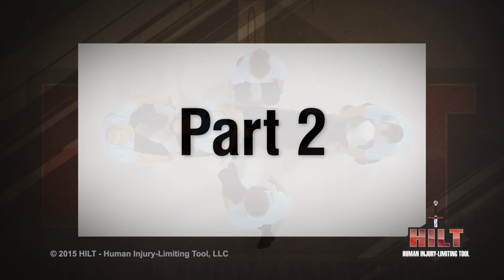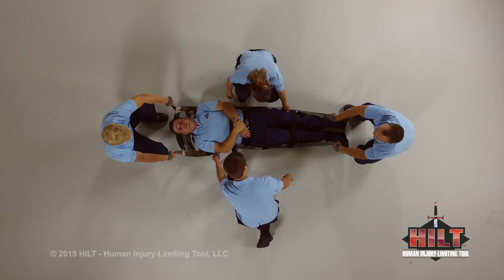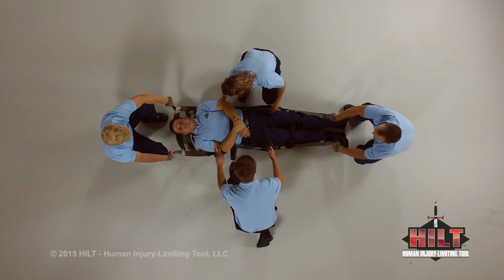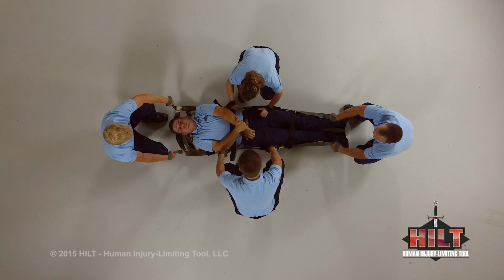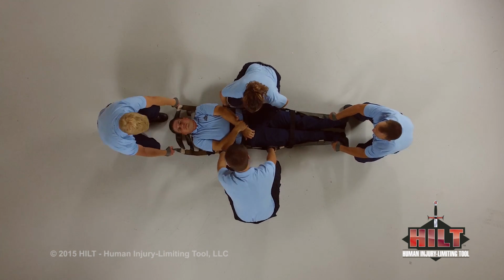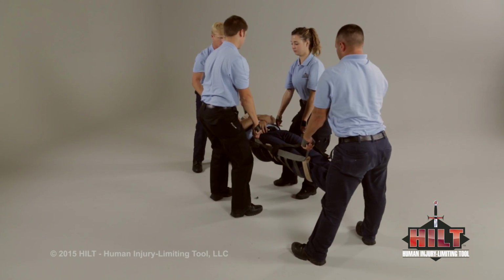Part 2. To lift a patient with a full-length HILT with base handles only, position one attendant at the patient's head and one at the feet. One attendant on each side of the patient will grasp both high-lift base handles. Prepare to lift. On 3. 1, 2, 3.